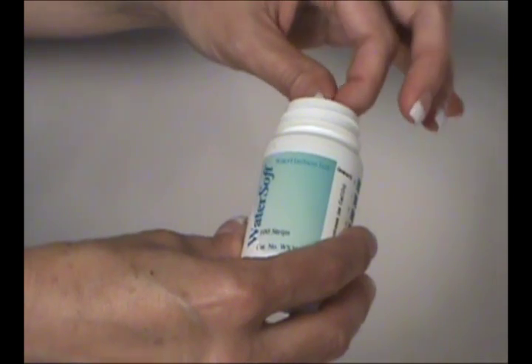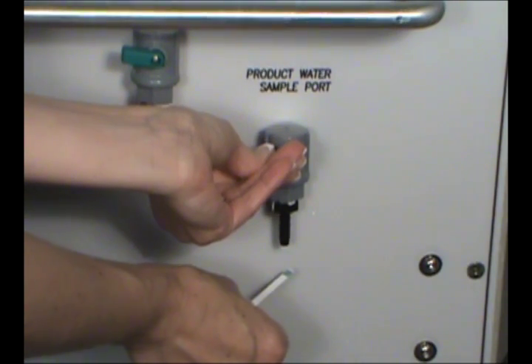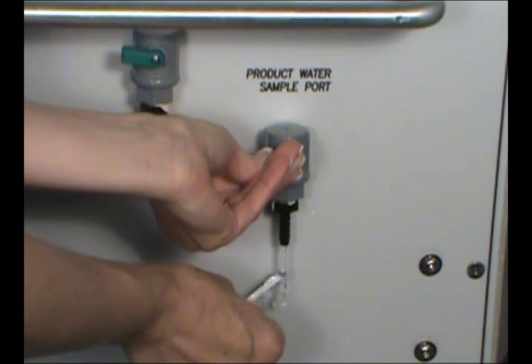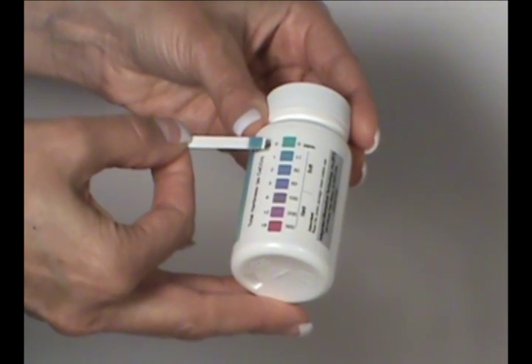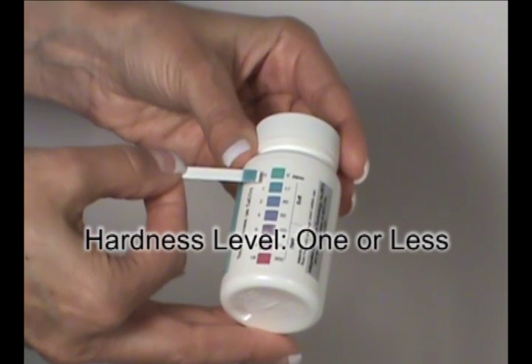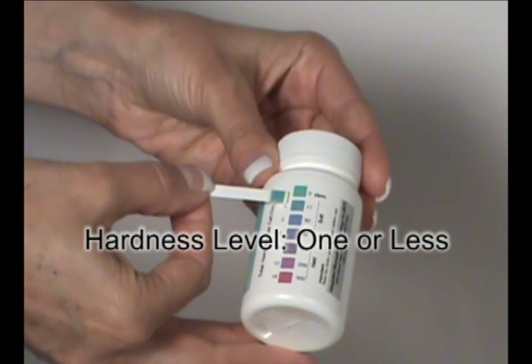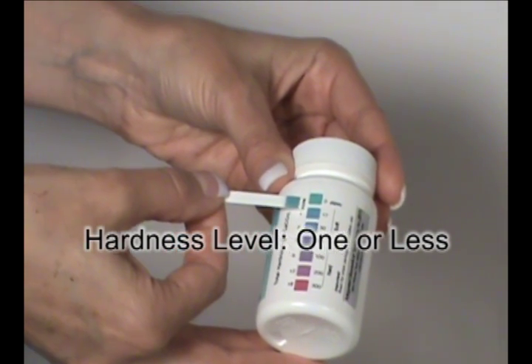Remove a water hardness test strip from the container. Wet the sample test strip from the product water sample port. Compare the color test result on the side of the container. The hardness level should be one or less. If the hardness level is not satisfactory, contact AmeriWater.